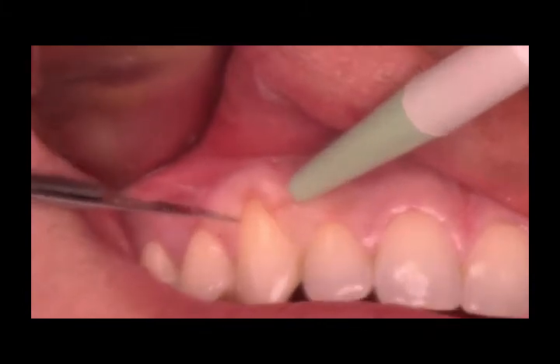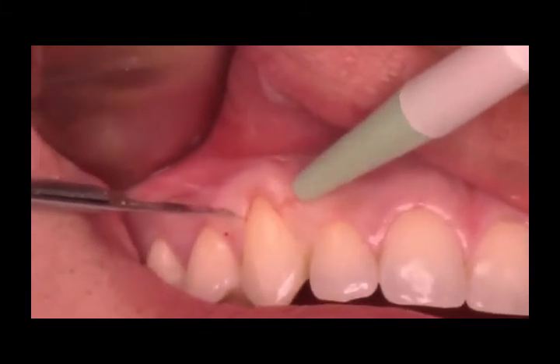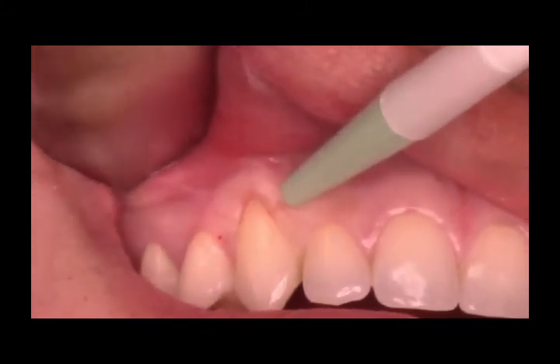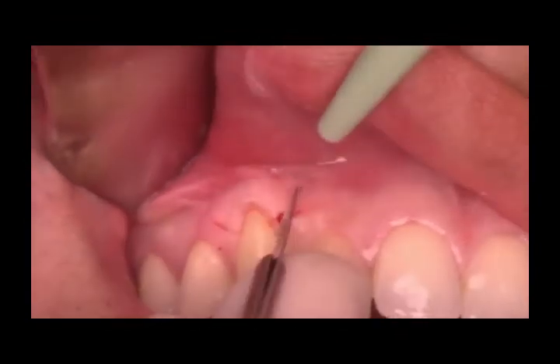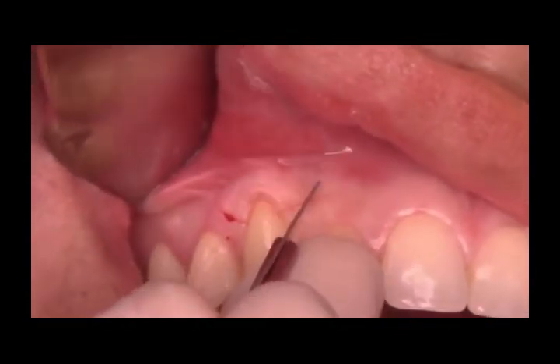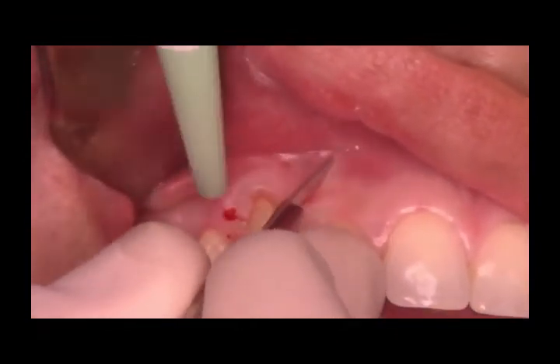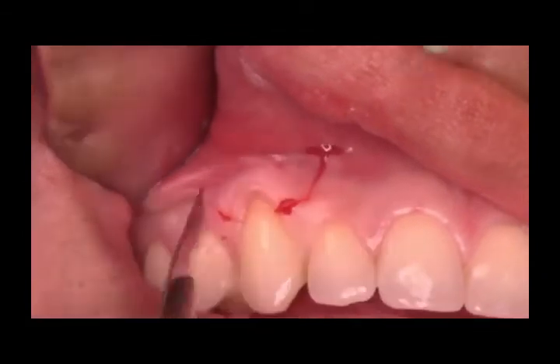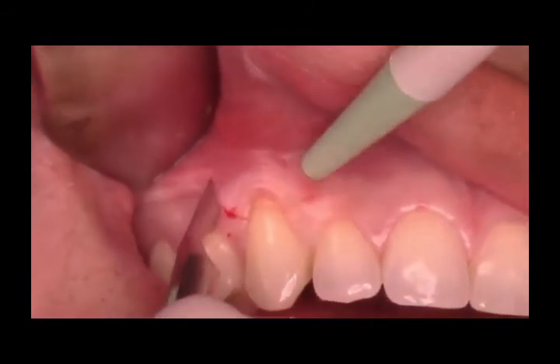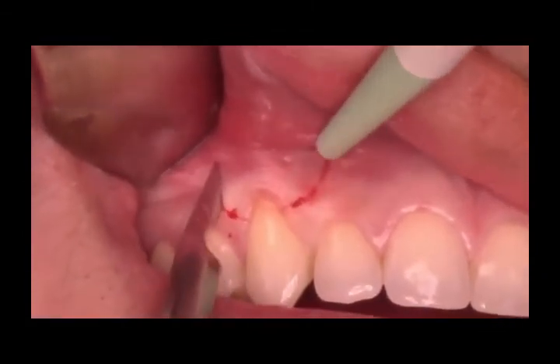Gingival recession is one of the leading causes of dentinal hypersensitivity experienced by various patients. Gingival recession can be treated with the use of flap surgery, with or without the use of grafts.